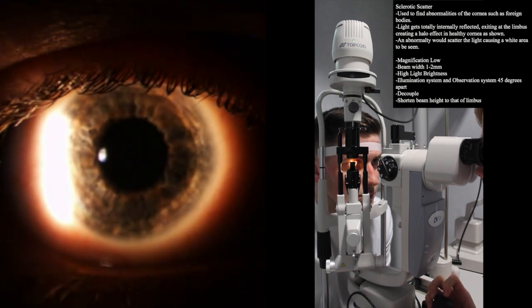If the cornea were to have any abnormalities, they would scatter the light, causing a white area to be seen at its location.